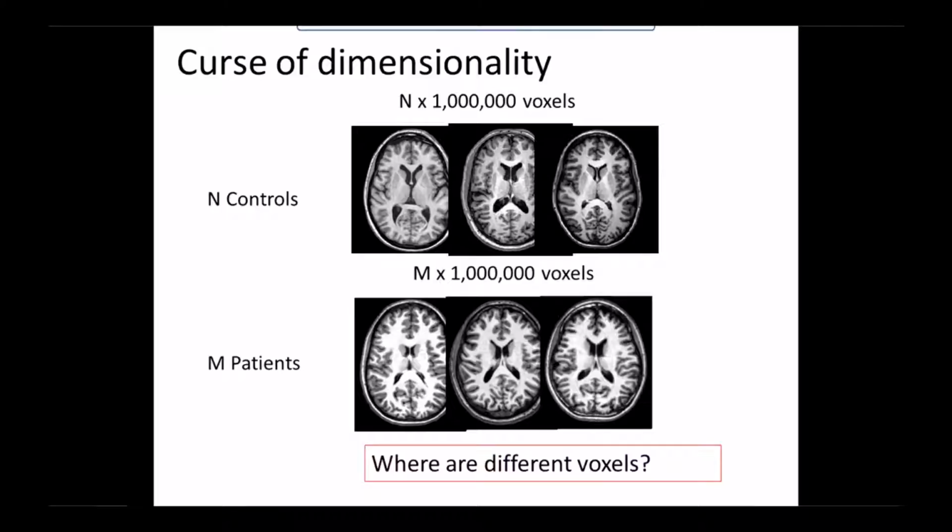So the art, of course, is how to reduce dimension and how to aggregate coordinates without throwing the baby out with the bathwater. I think that's the old expression. So the curse of dimensionality is something like, you have 1 million voxels and you have n images. You might only have 100 images. The standard radiologist in their lifetime to become an expert sees about 3,000 training images.